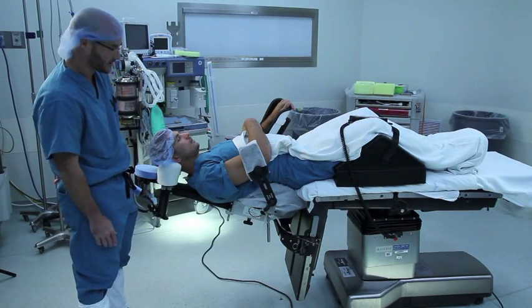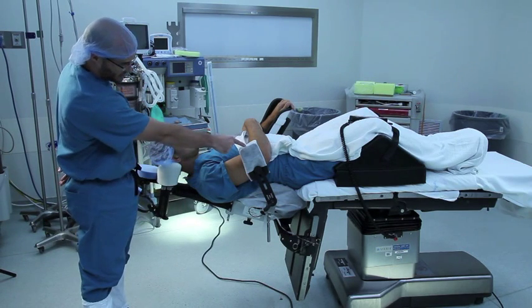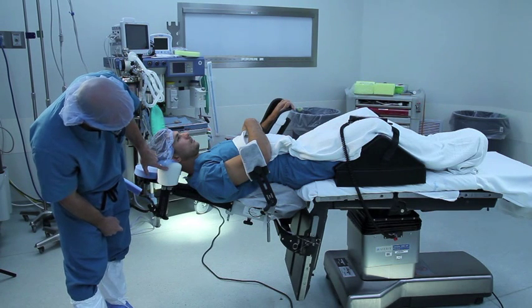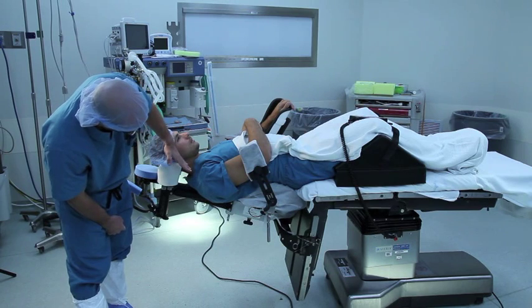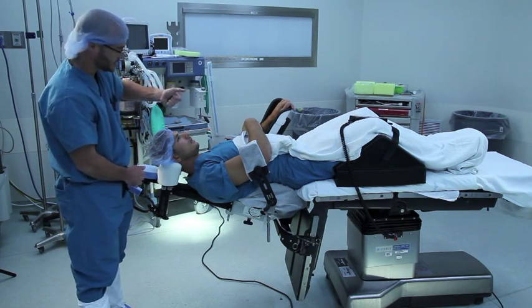This is an example of a common error in positioning the patient for intubation. The patient's hips are too low, such that the occiput is impinging on the neck pads. This creates an angle of the neck, which makes it very difficult for the anesthesia doctor to intubate.